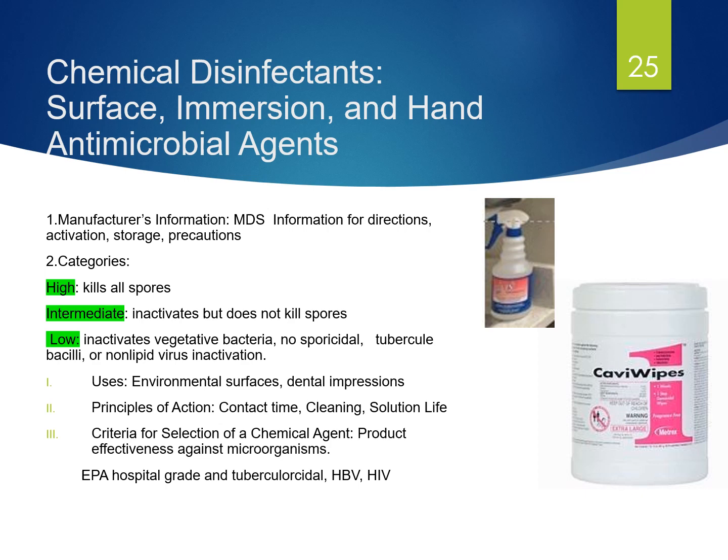We want you to use a wipe, and that's going to wipe your chairs, wipe your surfaces, dispose of the wipe, and then get another wipe. So we use wipe, dispose, wipe. We always want to use an EPA-registered hospital-grade disinfectant that has tuberculocidal activity and is also effective against hepatitis B and HIV.